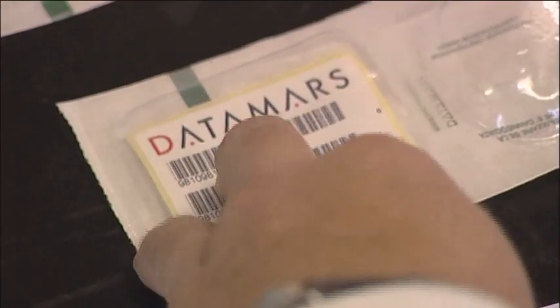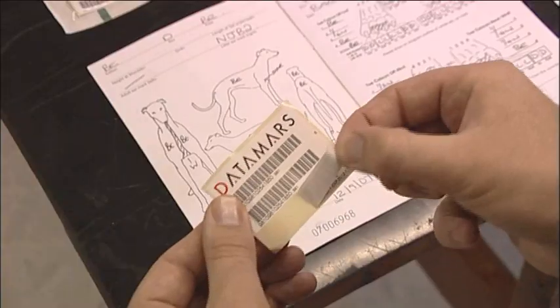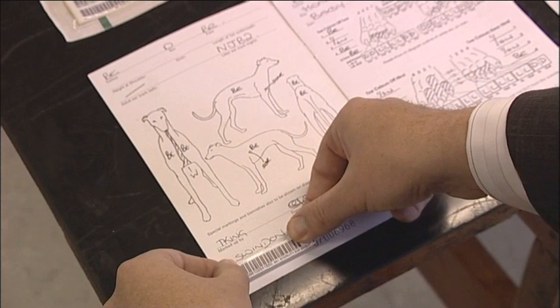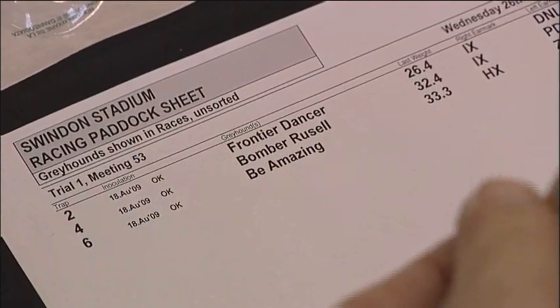Fix one barcode sticker into the inside cover of the identity book as a record of the chip number. The ideal location for this is the bottom left inside cover of the stud book. A second barcode is applied to the paddock sheet, which is retained as a record of the microchipping by the racing office.